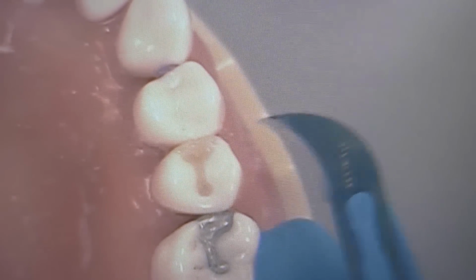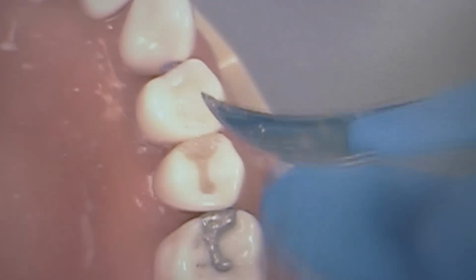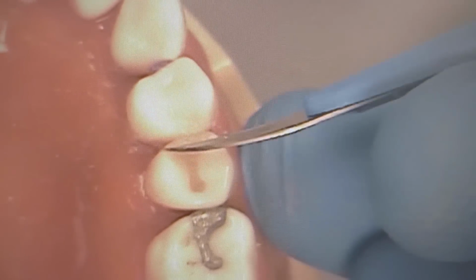I'm pretty much done here. Anatomy is okay, not the greatest. I'm using my blade to kind of help shape the marginal ridge just a little bit more. Using the blade to shape the marginal ridge right now.